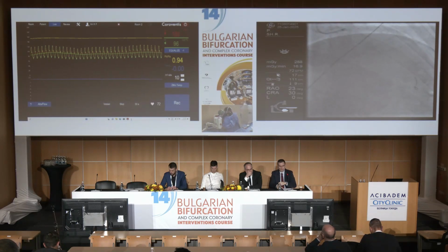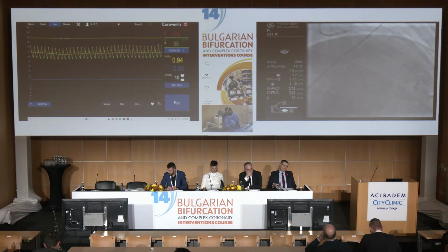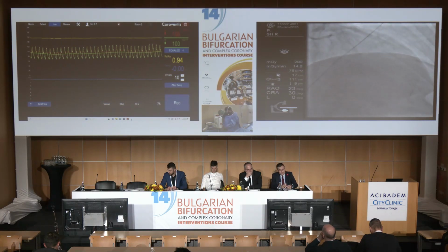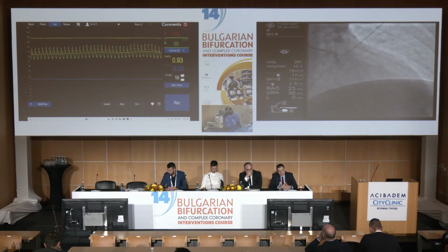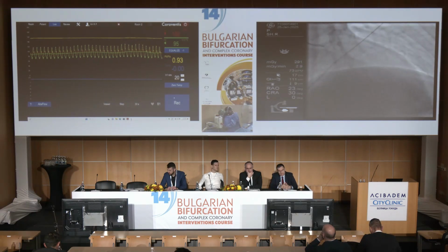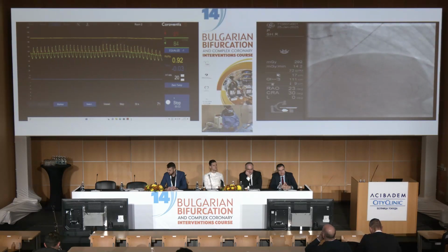That's very good news. You see that the PDPA is still exactly the same as before, so we are all set, but no longer to infuse 10, but to infuse 20. This is something I can change here. And I will start the recording, Tabo, whenever you want.